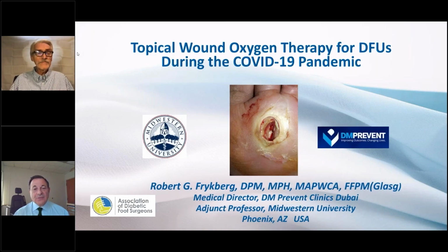I think that we're entering a new paradigm with more home care. This is a perfect fit for home care. It accelerates wound healing, accelerates use of the products that we're using for wound healing. And we've noticed that when we first apply this type of topical oxygen, which I should say is much different than the topical oxygen we heard about years ago, the RCT shows us that this is very, very effective in healing wounds, that we see a jump in wound closure on initial application. And so this has the ability to jumpstart those wounds and get them to begin healing because of what it does to the wound bed in oxygenating it.